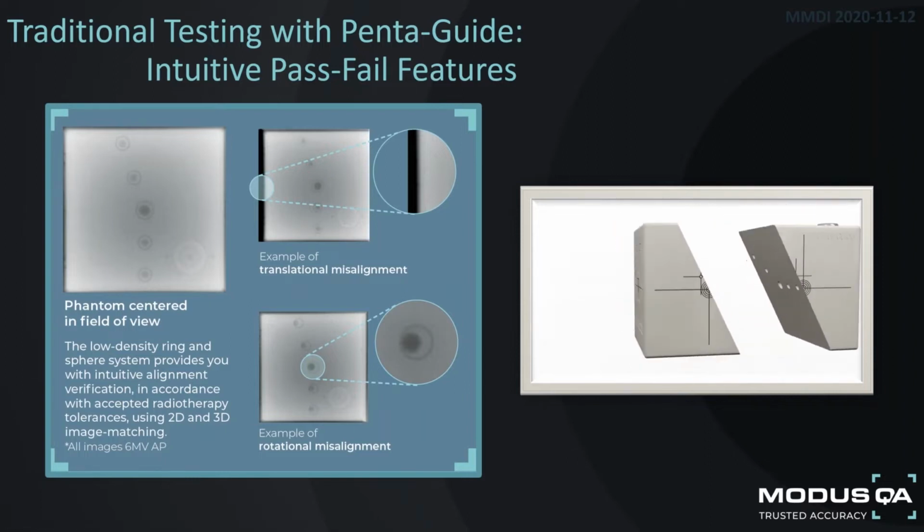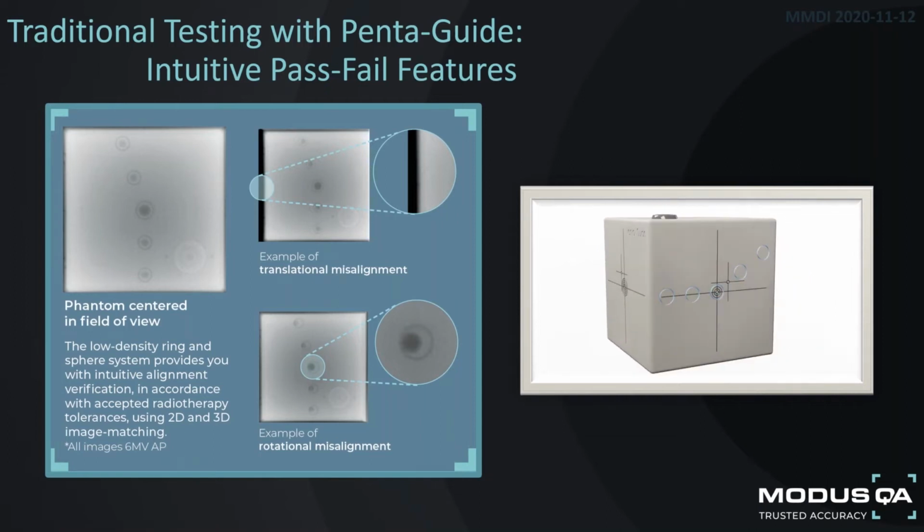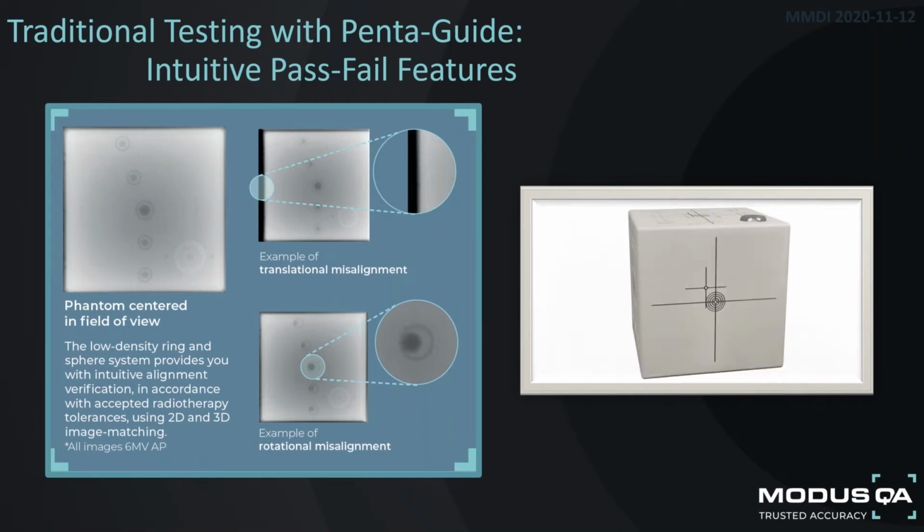Okay, so Rocco, you've mentioned to me that the Penta-Guide has some newer functionalities that some of our audience might not be aware of. Could you share these now?